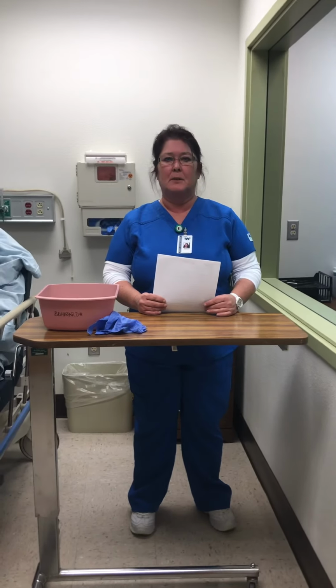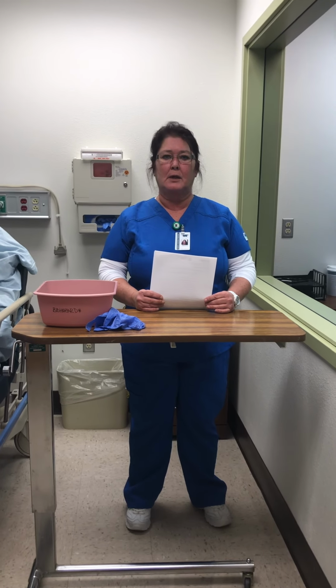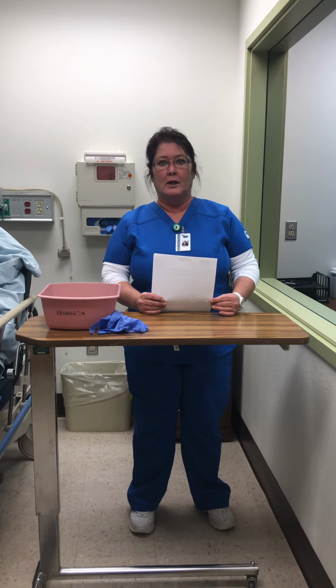My name is Tiffany, and I'm going to be demonstrating subcutaneous injections with an insulin pen and also mixing insulin using the insulin U100 needle.